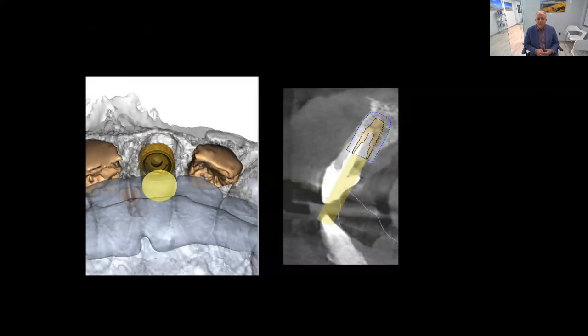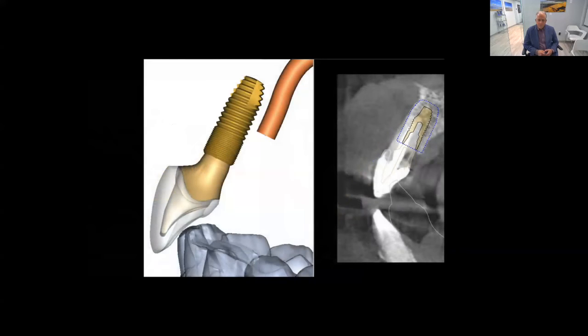So I felt comfortable that I could engage enough palatal bone and enough apical bone to get good primary stability. So again, I go through my planning. I want to exit out towards the cingulum. I want to be engaging palatal bone, and again, I want to be more apical. So this is my implant plan. And again, the beauty of 3D planning is I can really start to envision how I want my final restoration to look, and again, where my vital structures are.